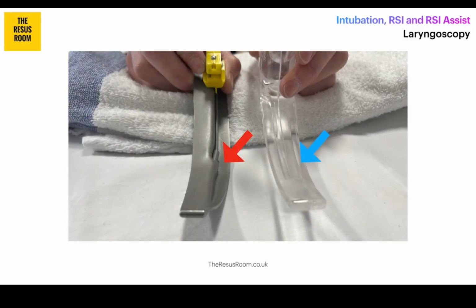What you also want to do is have a look at the blade itself and to see if there's a tongue channel. Now you can see here that with the direct blade, on the left hand side, the red arrow shows the channel that you're going to use to sweep the tongue and collect it over to the other side of the mouth to create some space. Now with the VL blade on the right hand side, where the blue arrow is pointing, you can see that there isn't a channel to sweep a tongue. So some would argue that it's going to be a slight tweak in how you're going to use this VL blade, and that you might as well approach via the midline, because you're not going to be able to sweep the tongue out of the way. Therefore you can stay more easily orientated to the center point.